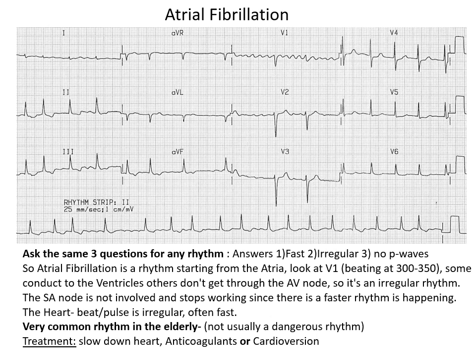And lastly, we can cardiovert this particular rhythm. So we can put paddles on the chest, we can sedate the person, and under certain circumstances, we can cardiovert them to try and change the rhythm back to sinus rhythm.